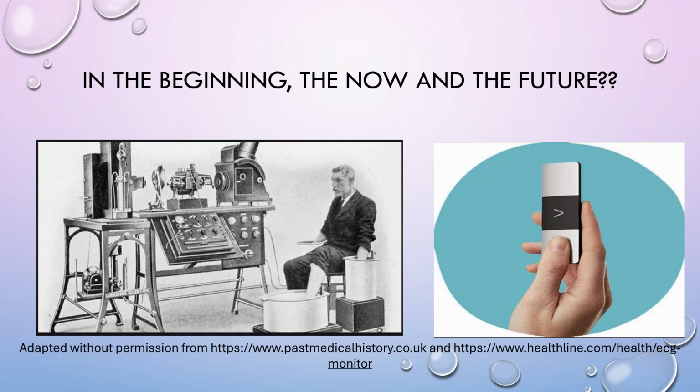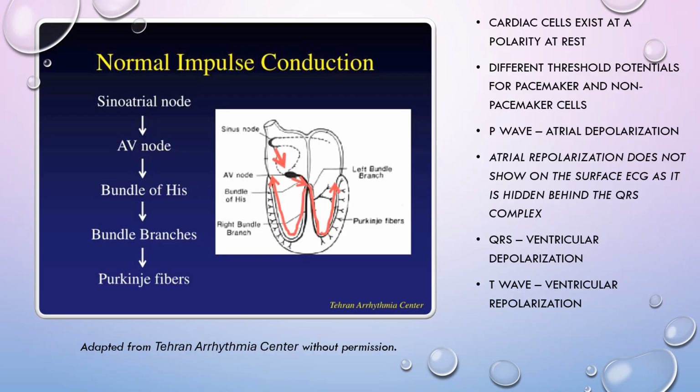Today, we can see this little device on my right that looks barely bigger than a flash drive that we can use to take a heart tracing. And this is just so convenient and so beautiful. It can be carried by the patient anywhere and then relayed to the physician. Now, what does the future bring? Honestly, your guess is as good as mine, but let's hang in there. Who knows? We will get to that future and we'll see.